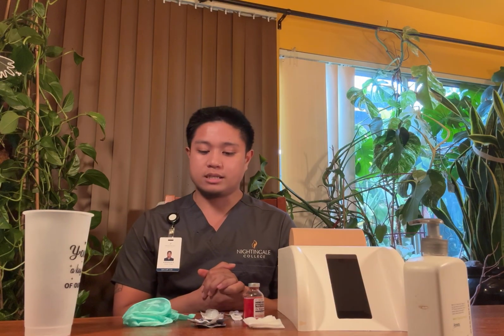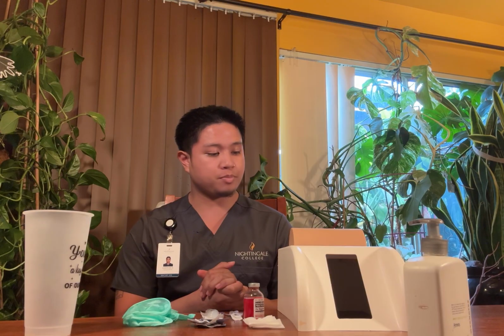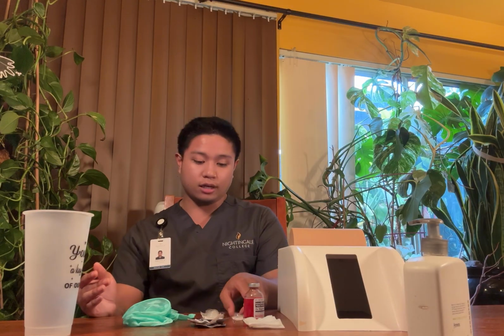Hello, my name is John Zamora, and I'll be performing administration of intramuscular injection for my BSN 225 course at Nightingale College. Before we begin, we just want to make sure that we have the right supplies with me. So I have my patient, I have my needle.